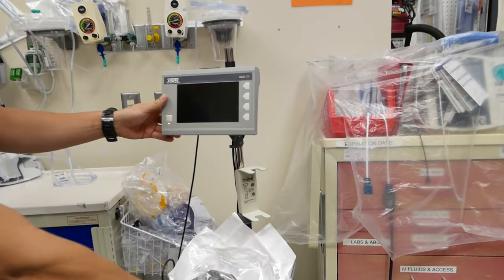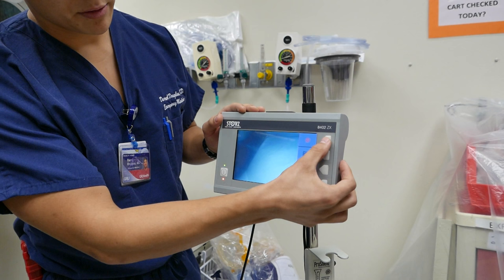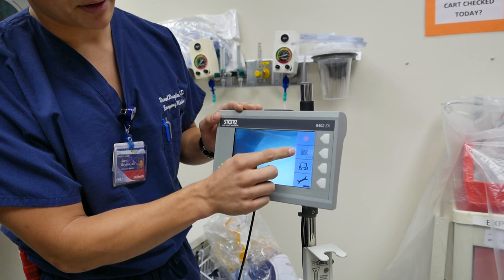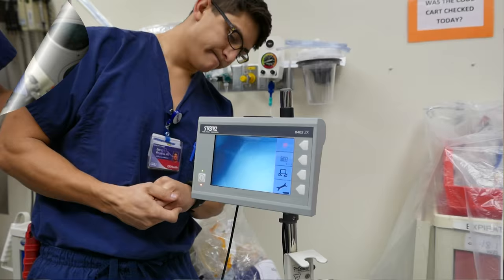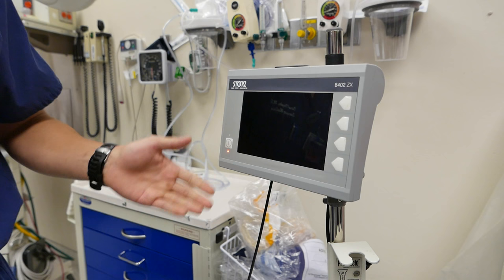You can actually do video with this thing too. There's a record button right here. Of course you have to have a card in place, and there's a picture button right here — you can see the camera icon. We don't have a card in place, and that's why it is grayed out. This same screen will help with any of the video bronchoscopes or MP scopes that Storrs does. It's a nice all-in-one system that they've used for connectors.